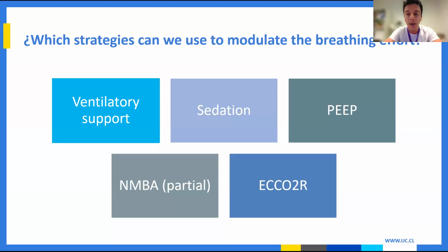PEEP: there is some current evidence that PEEP can affect the respiratory drive and the effort depending on the compliance. If you recruit some areas with PEEP, probably the drive of the patient will decrease, and also you can alter the geometry of the diaphragm, so your drive and your effort will be modified.